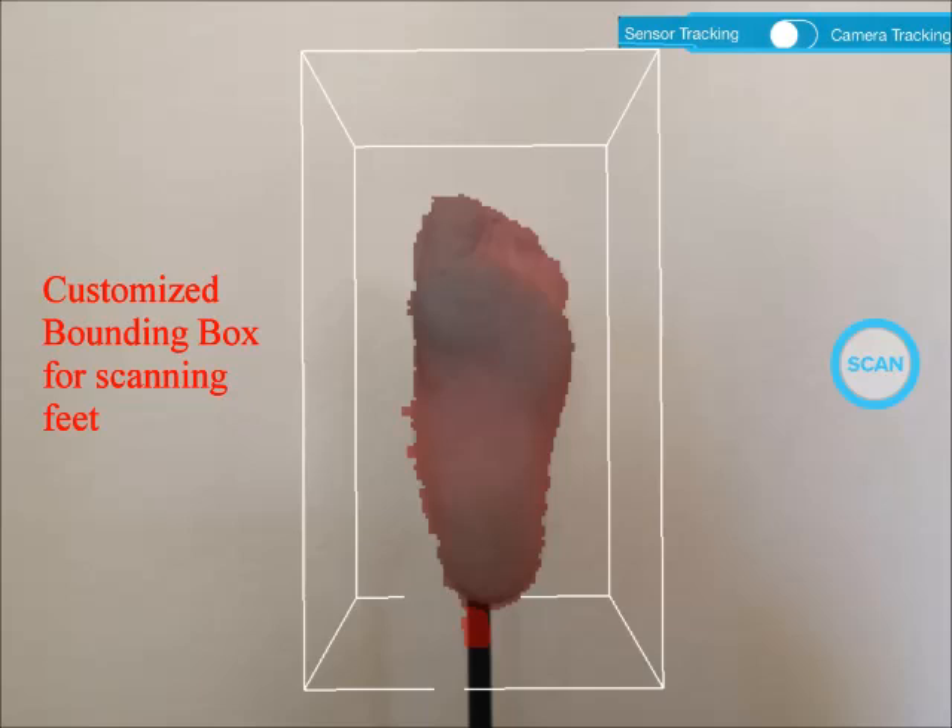After choosing left or right foot, we are now entering the aiming mode. In this mode, we need to aim the target and tap the scan button to scan. There is a bounding box outlined by the white lines. In this app, the bounding box is customized for the purpose of scanning feet. Before you tap the scan button, there is a lot of skills you need to learn and practice. Let's go through them in detail.